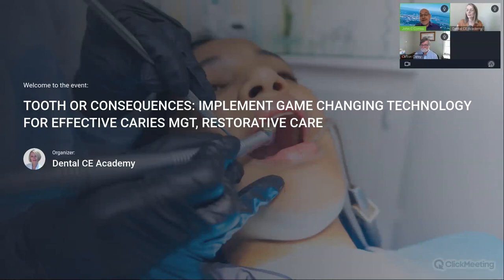Basically, I'm a fan of the ISOVAC Isolite isolation system. We use that at the college as well, simply because you're getting the patient to relax and bite gently onto it while they're working. It's removing all kinds of saliva. Under a rubber dam, you sometimes get the swamp developing. So we advocate both of those. Our students like the Isolite better than the rubber dam, but they need to know how to place rubber dam properly for board examinations. So we use both. And in my private practice, I use the Isolite predominantly for most, if not all, of my procedures.